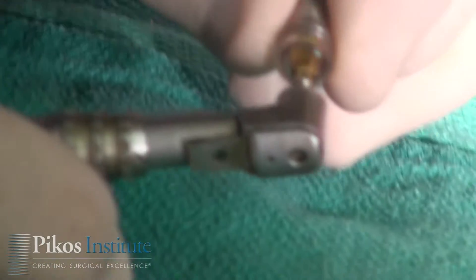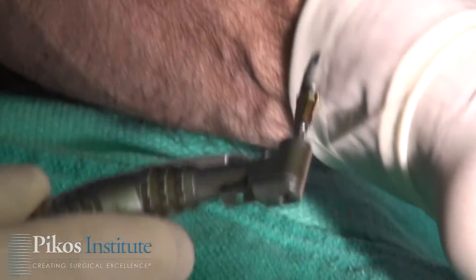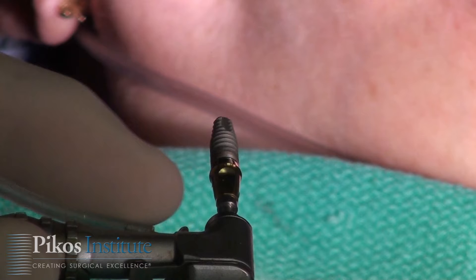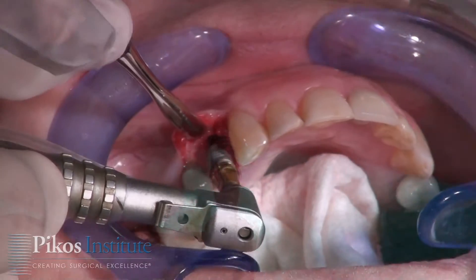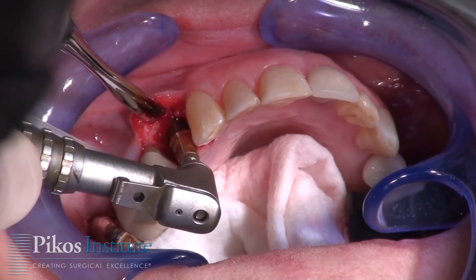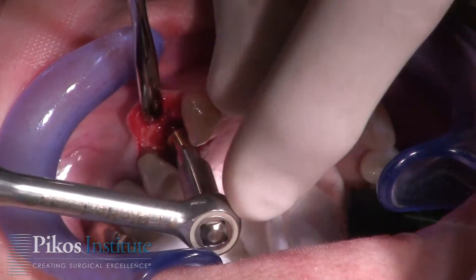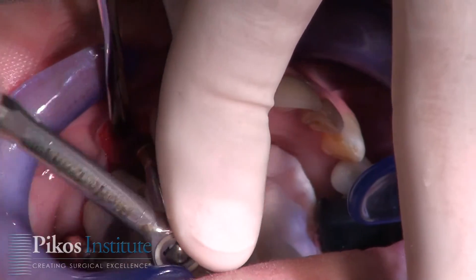The implant will be a 4.6 by 12, so now we'll go ahead and place our insertion bit right into the implant body. Here we are with the Bio-Horizon tapered internal laser-lock implant. This is the 3-in-1 abutment that acts as a mount, preparable abutment, and an impression coping. We'll introduce it to the field, and we're binding quite well, so now we'll just manually complete the implant placement.